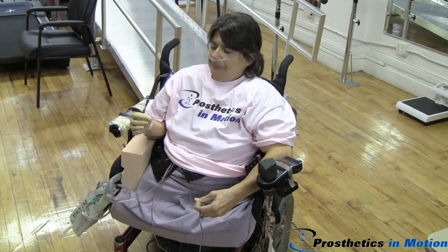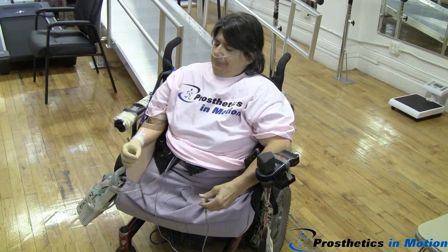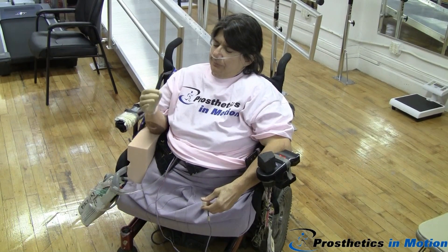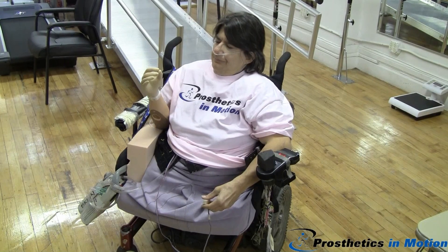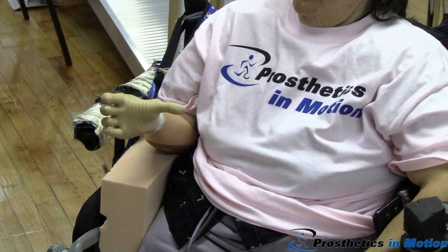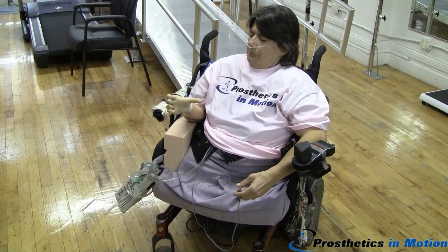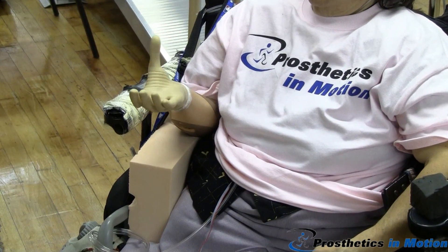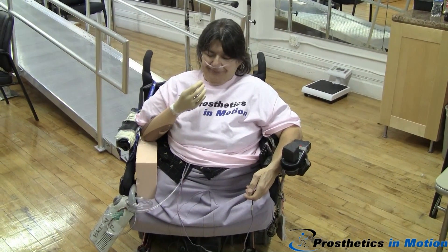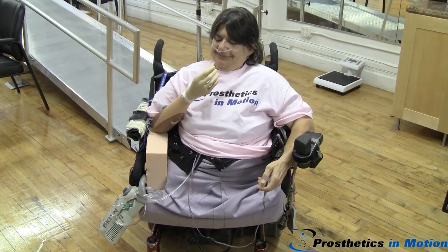All right, now here we go. So, let's go. I can't believe I waited 40 years.